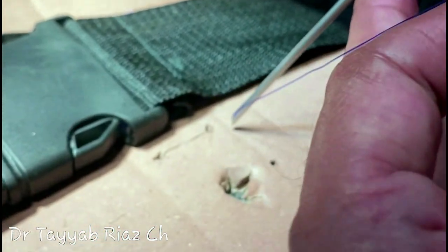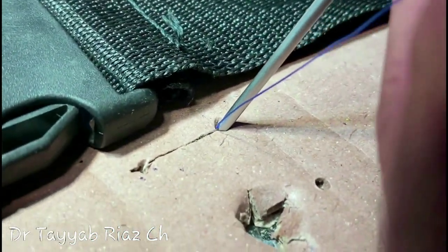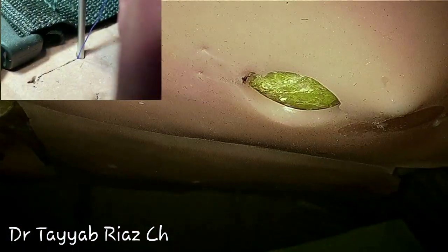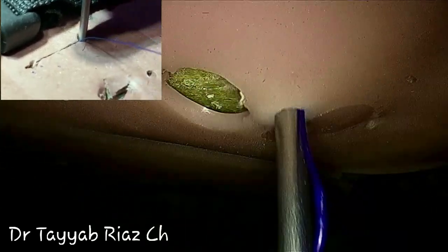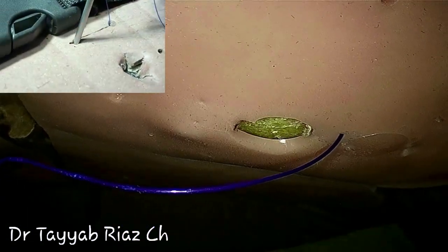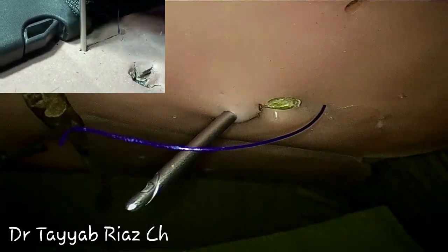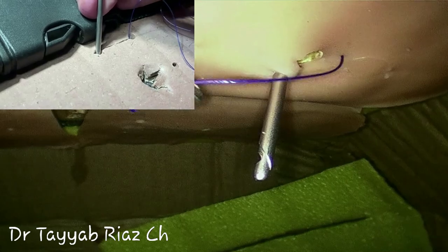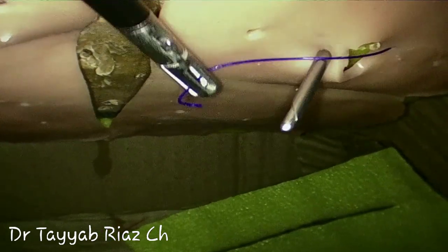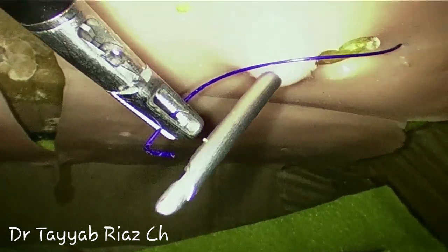After that, you insert the needle through the same 10 mm defect and puncture the peritoneum about 1.5 to 2 cm from the margin of the defect inside, and then release the stylet and remove the Veress needle and insert it again through the same 10 mm defect on the opposite side, again at the same distance, and with the help of a left hand instrument, feed the end of the thread to the side eye of the Veress needle. This is a very fine movement and it needs rehearsal.